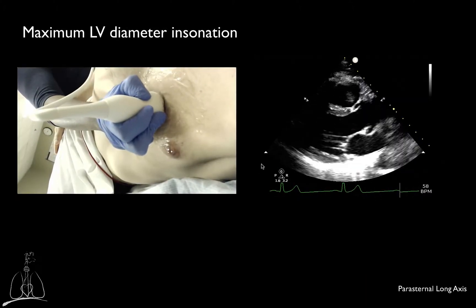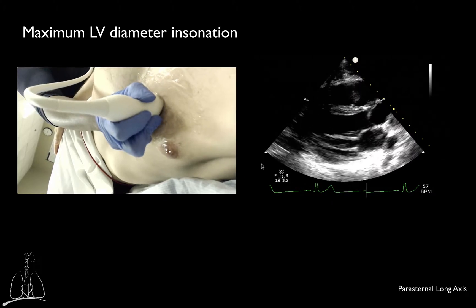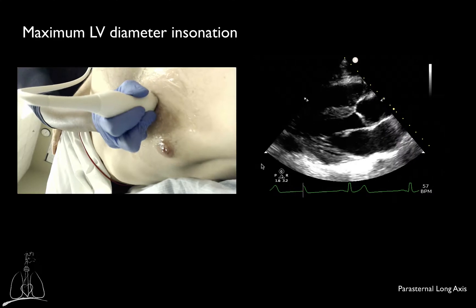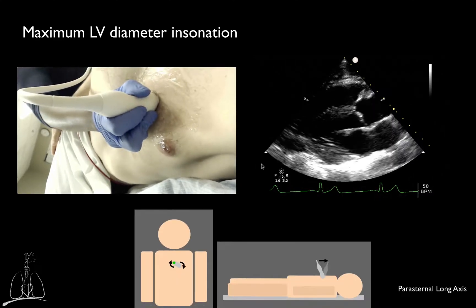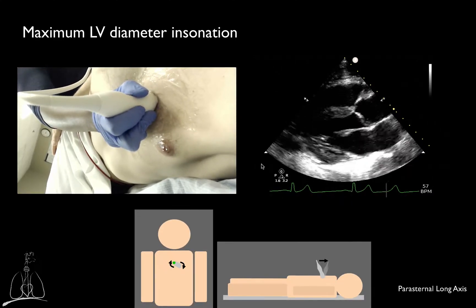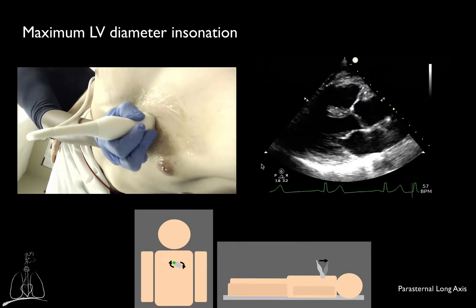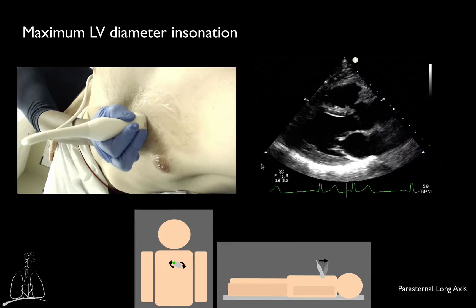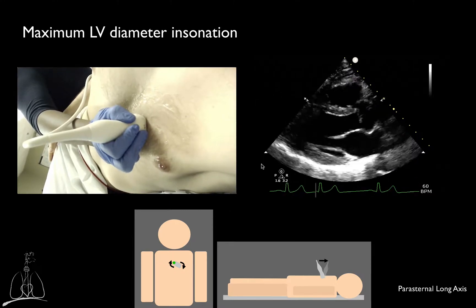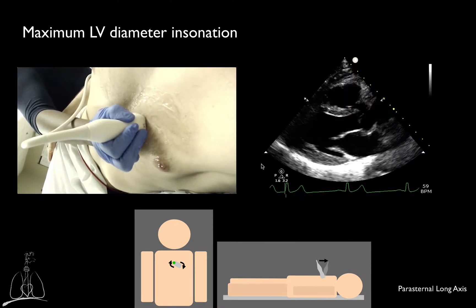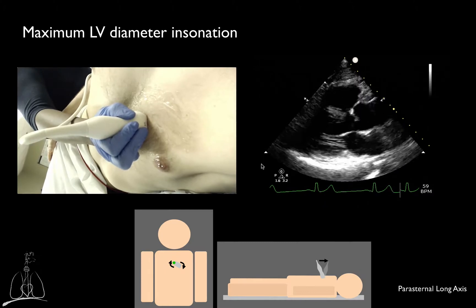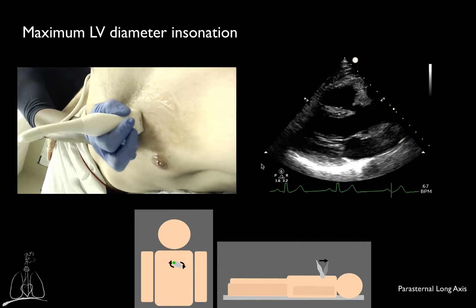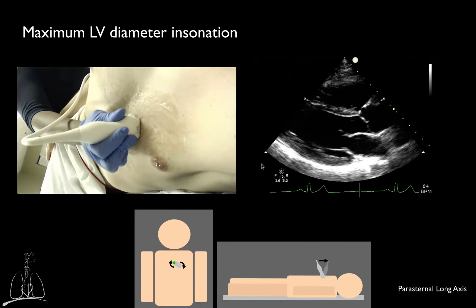Similarly, you should be able to insonate the entire LV long axis in its maximum diameter. To achieve this goal, two transducer manipulations can be attempted. Rotating the transducer in either direction will allow you to identify a sonographic plane that is parallel to the LV long axis. You may then tilt the tail of the transducer upward or downward. You may have to adjust both rotation and tilting several times until you obtain an adequate view.